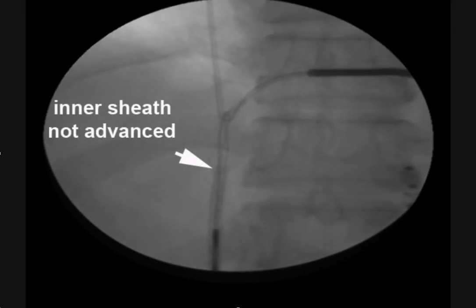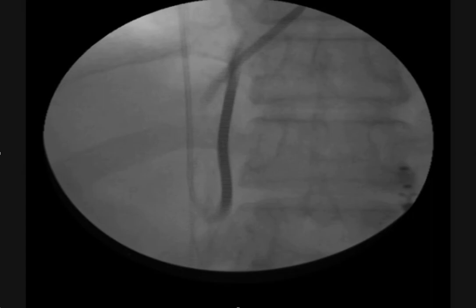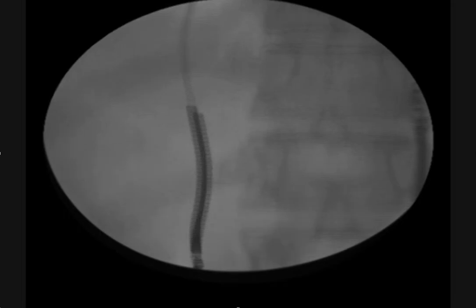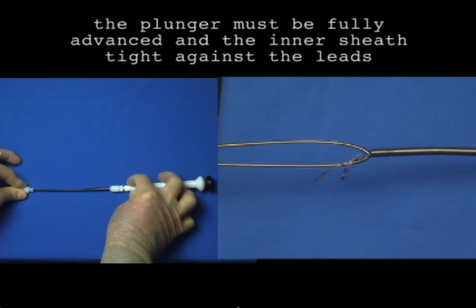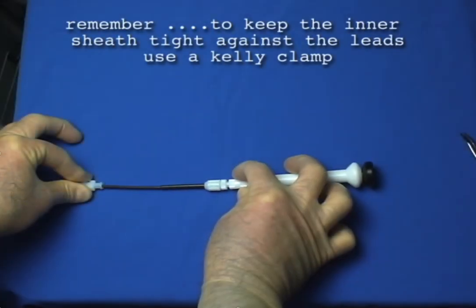And once it lets go, it just slides right through. I've heard some very experienced extracting physicians complain about the system where it releases the lead. And it's just because it's very easy to slide this inner sheath back while you're pulling on things. And then if you do that, then it gets released.